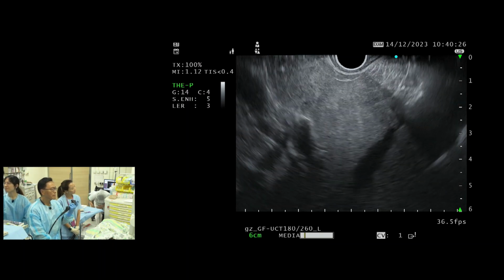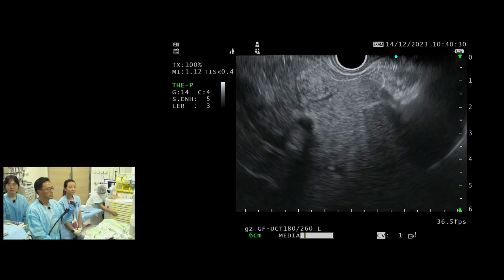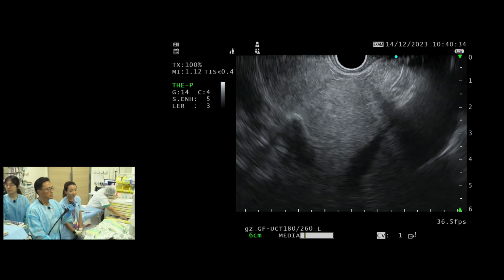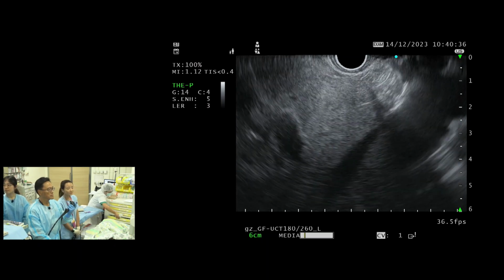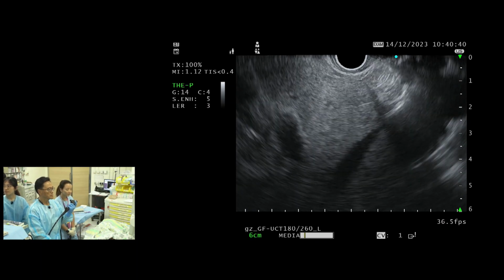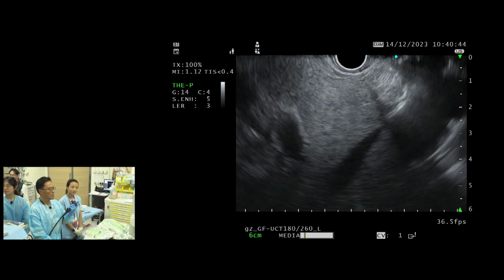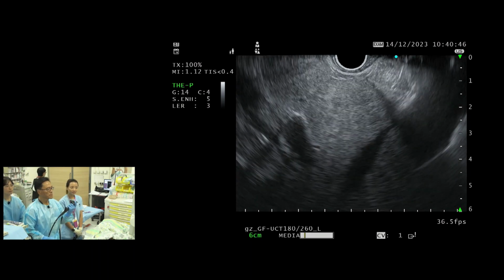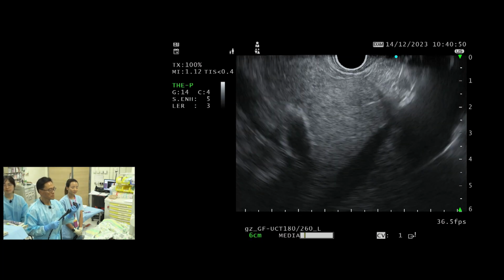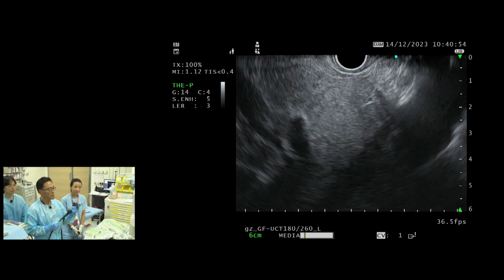Well, Kenneth, if I remember correctly, if the portal pressure is less than 12 millimeters of mercury, there won't be much risk of bleeding from the varices. But you are measuring different branches of the portal vein. Would the pressure in the main portal vein be different from the smaller branches? And as you said, this patient already developed varices. What is the additional information that you can get by probing into the vessels?